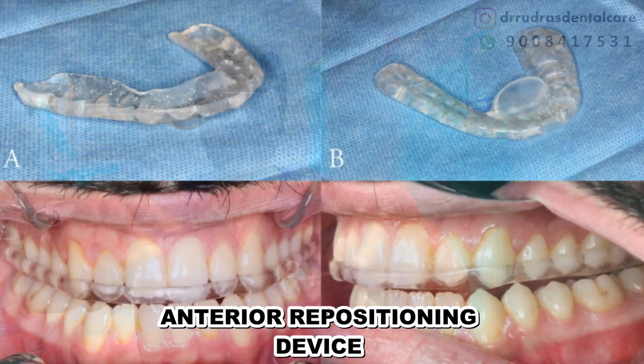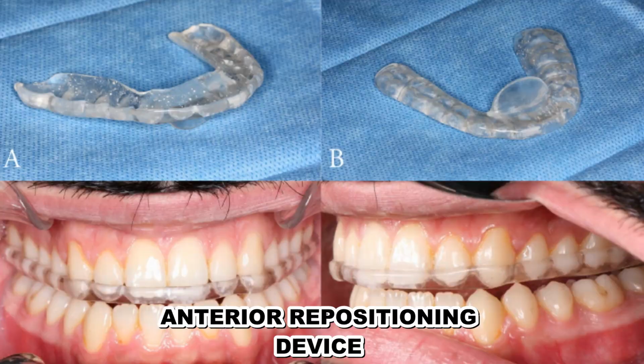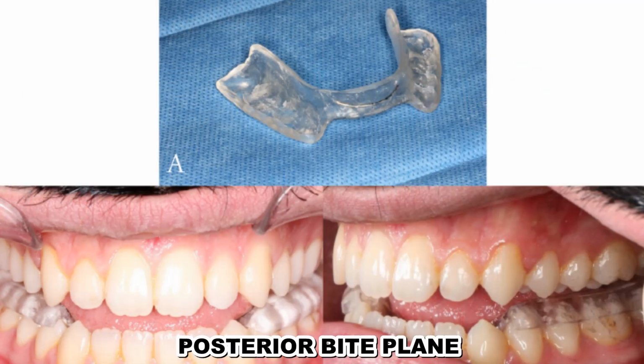Then you have something known as directive splints or non-permissive splints, where the condyle moves forward. This could be because of any sort of discal injury or any sort of issues with the disc of the temporomandibular joint, and you have an anterior repositioning device which basically puts your jaw forward, and you can have a posterior bite plane that helps in making sure that your teeth are in a relaxed position, and it is limited to basically if you're having any sort of excursive or protrusive movements, that's why you give the posterior bite plane so it doesn't move away.